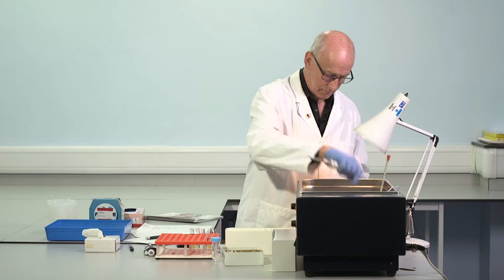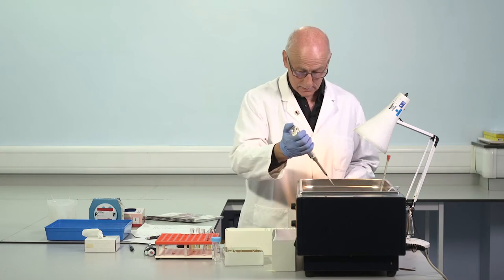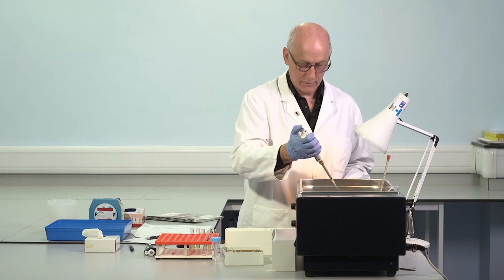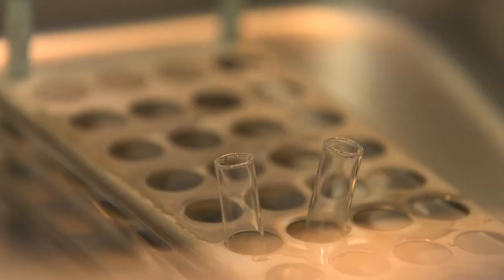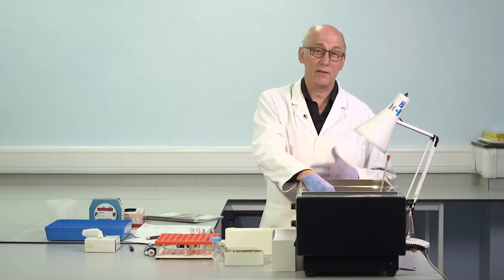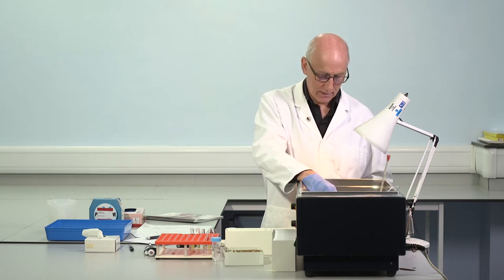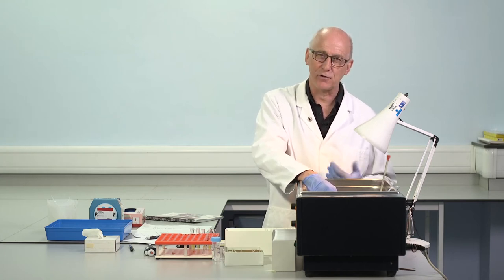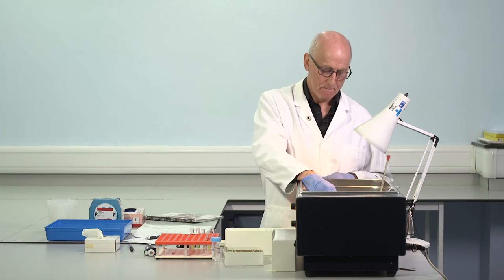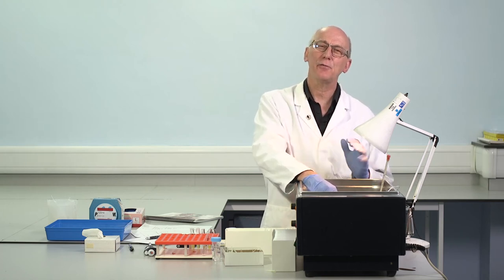3 minutes. Calcium to the first. 3 minutes 15. Calcium to the second. In my centre, we test 20 to 25 each time we change a lot number of APTT reagents. And I'm convinced that's sufficient for clinical management purposes. Especially because we should think about how we use the information.